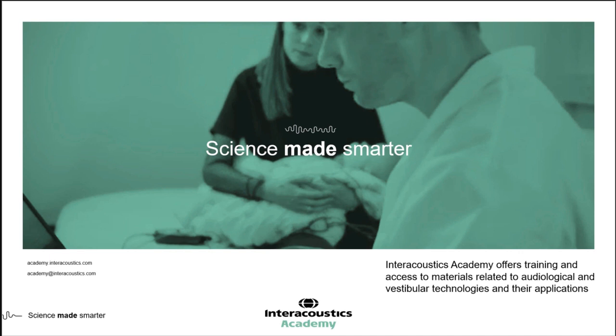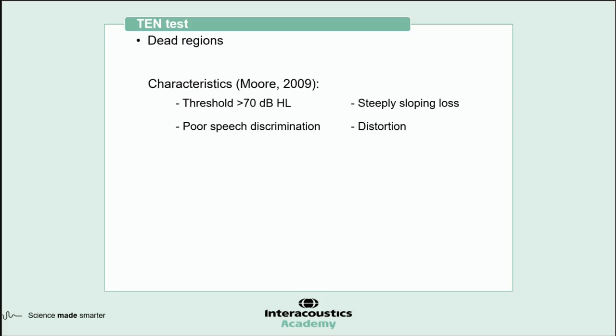Let me just whiz you all the way back to where we were before. I think it's difficult because it's quite an individual thing, as is everything in audiology. The indications are when your threshold is over 70 dBHL, if there's a steeply sloping hearing loss, if somebody's reporting poor speech discrimination, or you've measured that, and whether they're struggling with distortion or they report distortion. And you can have any combination of those. So in terms of whether there's figures and data as to how often that combination appears, I don't know off the top of my head, but it's certainly worth me going and having a look into.